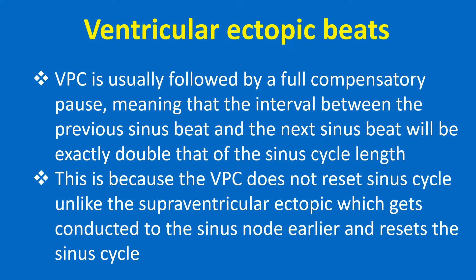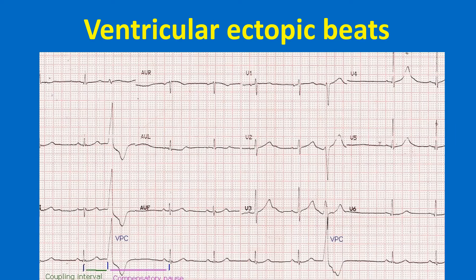This is because the VPC does not reset the sinus cycle, unlike the supraventricular ectopic, which gets conducted to the sinus node earlier and resets the sinus cycle. The basic rhythm in this ECG is sinus rhythm at around 60 per minute.